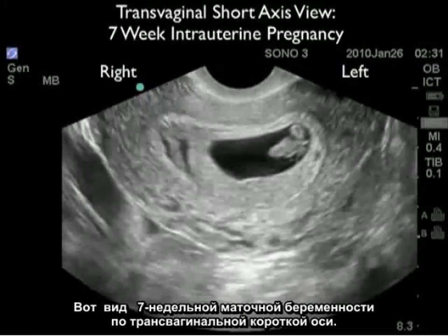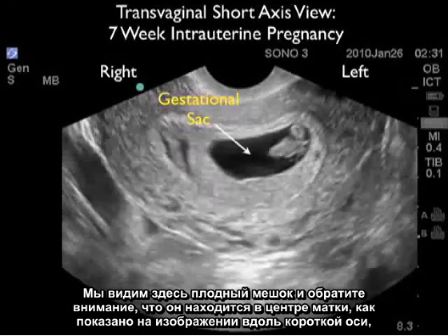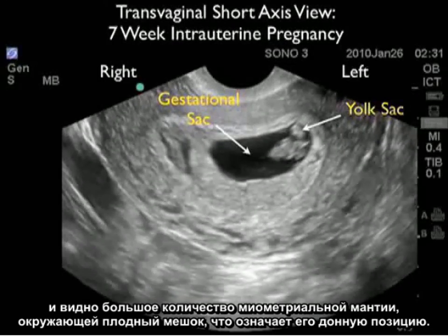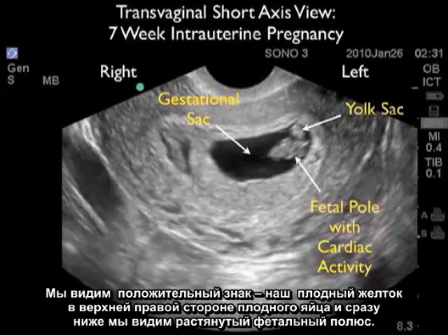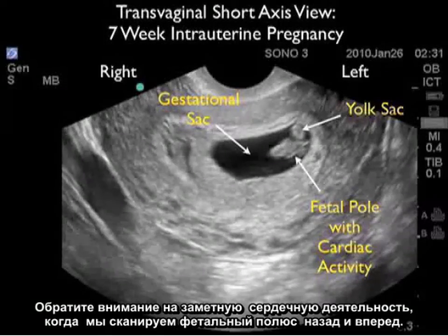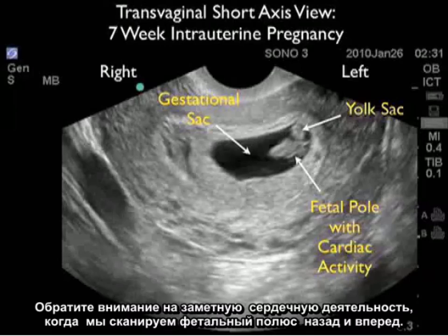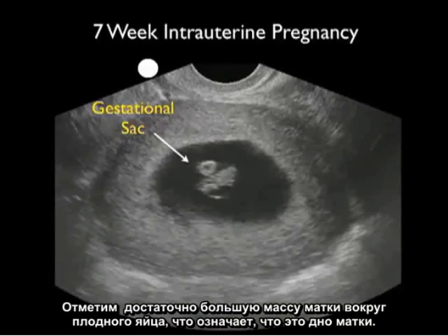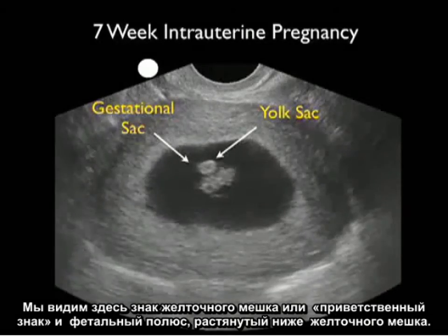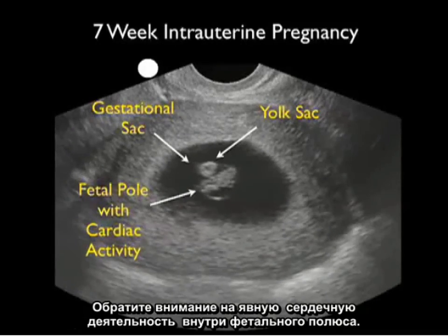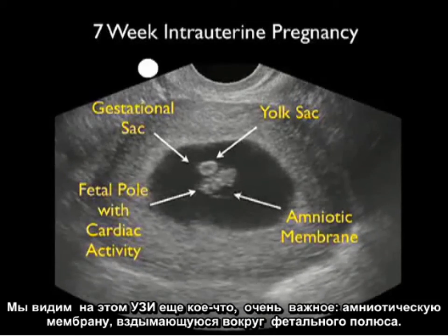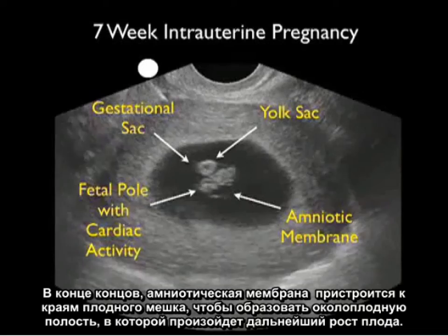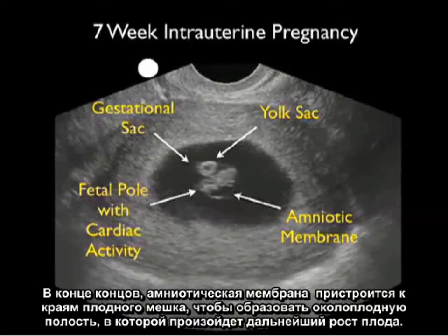Here's a transvaginal short axis view of a 7-week intrauterine pregnancy. The gestational sac is located in the center of the uterus with a good amount of myometrial mantle surrounding it, signifying a fundal location. We see the positive cheerio sign or yolk sac to the upper right aspect of the gestational sac, and just below it the fetal pole stretched out with positive cardiac activity. In another 7-week intrauterine pregnancy also in transvaginal short axis, we again note the yolk sac, fetal pole with cardiac activity, and importantly the amniotic membrane billowing out from around the fetal pole — which will eventually plaster down on the margins of the gestational sac to form the amniotic cavity.